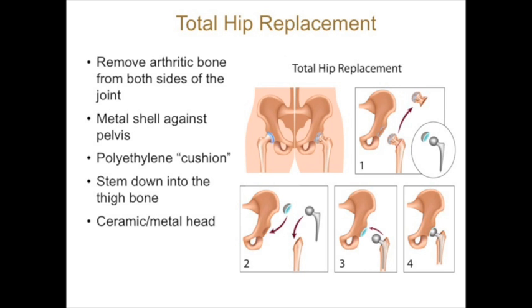So just to review again what Dr. Shields had mentioned, what we do during a hip replacement is remove the damaged bone. We take out the ball, ream into the acetabulum, take out the damaged bone, and ream into good, bleeding, healthy bone, and remove the bone spurs. So what we're doing is putting in this metal stem. It's a titanium cementless stem that we typically use. It's a titanium cup.